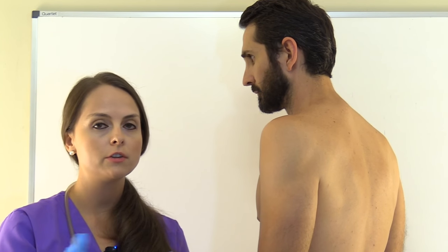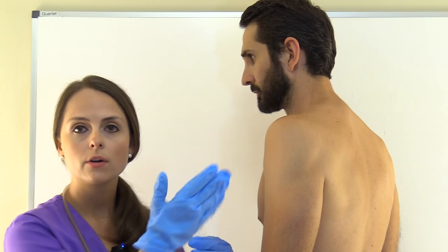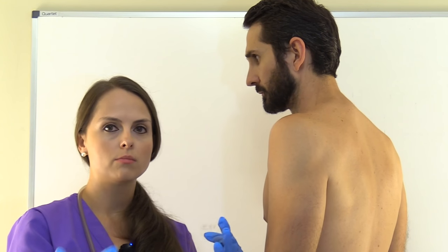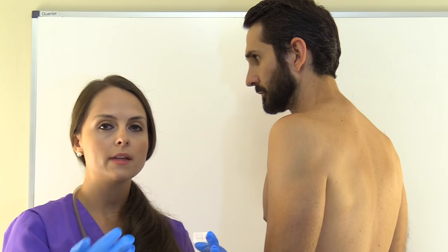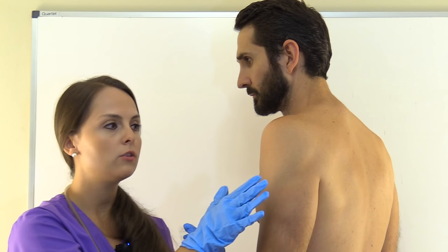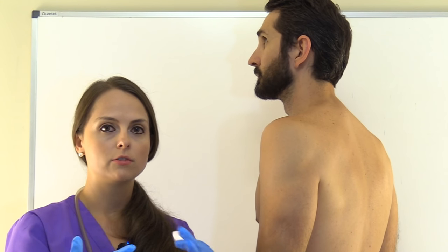When placing the patch, don't put it back on the same site you removed it from — rotate sites. You can use the upper chest, the other upper arm, or the back. Make sure the skin is completely intact, no rash, not broken. If the area is very hairy, clip the hairs — don't shave. Don't apply it over any lotions or creams. If the skin is dirty or oily, clean it with water only — no soaps with lotions, as that can affect how well the patch sticks.